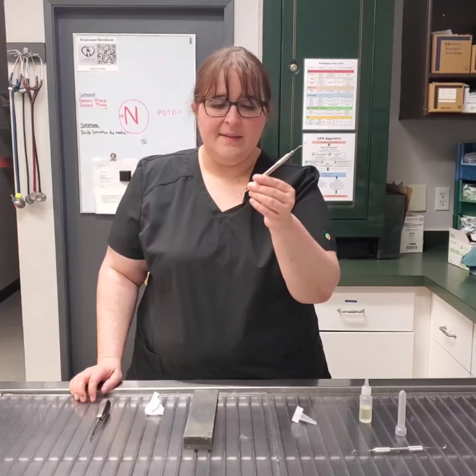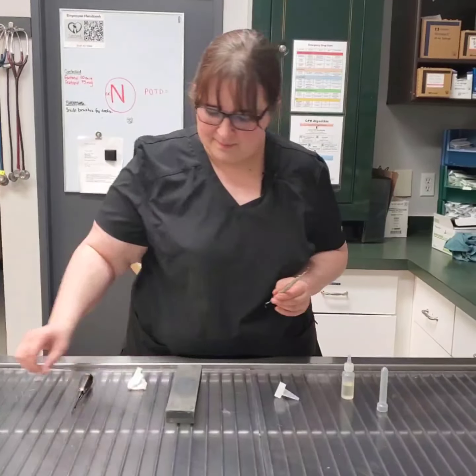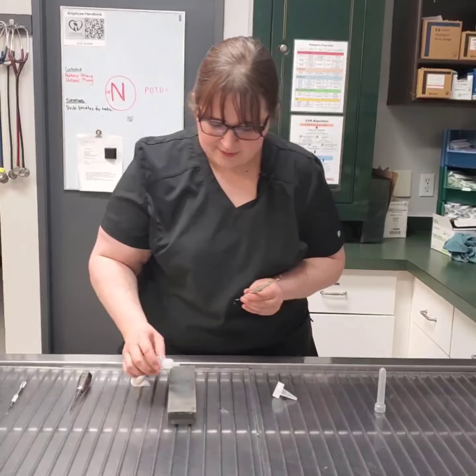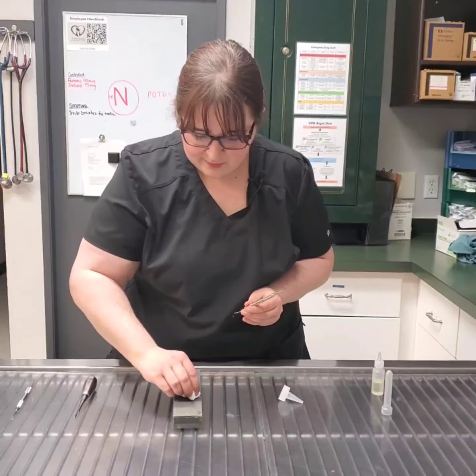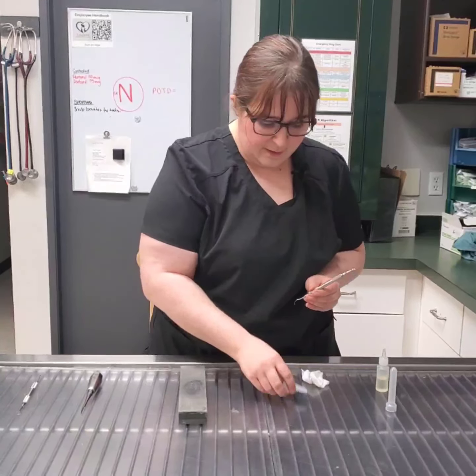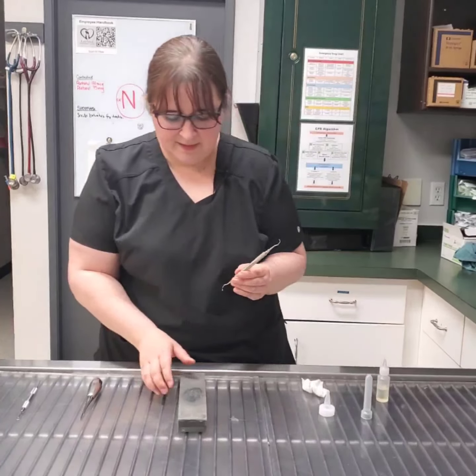So now I'm going to be demonstrating how to sharpen a universal curette. So we have exactly the same tools. We have the sharpening stone. I'm just going to add another couple of drops of oil, just spread that around. And we have my makeshift conical sharpening stone and the syringe case to test our sharpness.